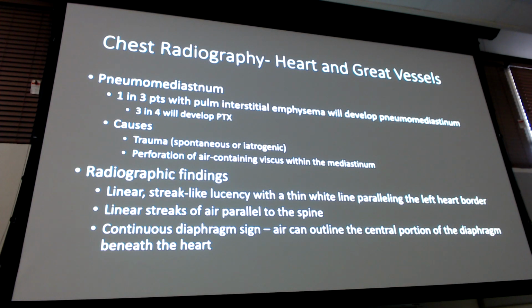All right. Don't get tripped up by the little medial scapular border edge. Don't get tripped up by the skin folds, the walls of the blebs, or sorry, the bullae. One's a bleb, one's a bullae, one's small, one's big. We'll see that here in the lectures. Don't get tripped up by those. Remember that radiopaque line has to go along the walls of the thorax in order for it to actually be the pneumothorax, because it's that visceral pleura that's going through there.